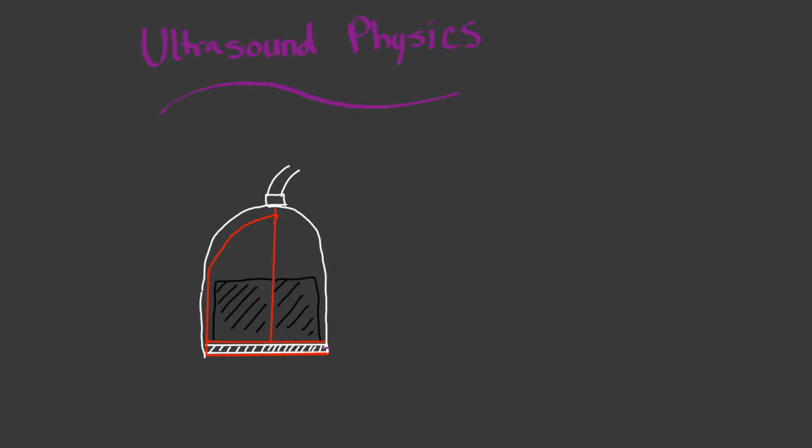To start with, I'd like you to understand how ultrasound is generated. So I have a crudely drawn ultrasound probe here. And the probe is based on this thing right here. And this is a crystal. It's a synthetic type of crystal that has been heated to a high temperature so that it can attain what's called a piezoelectric effect. Now what that means is that when a charge is applied to this crystal, it vibrates and creates a sound wave. And the thickness of that crystal determines the frequency of the sound wave.